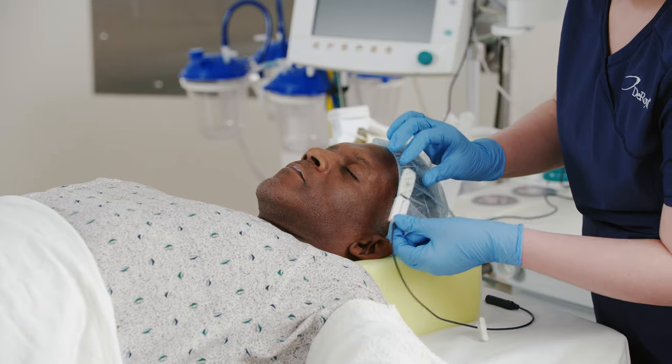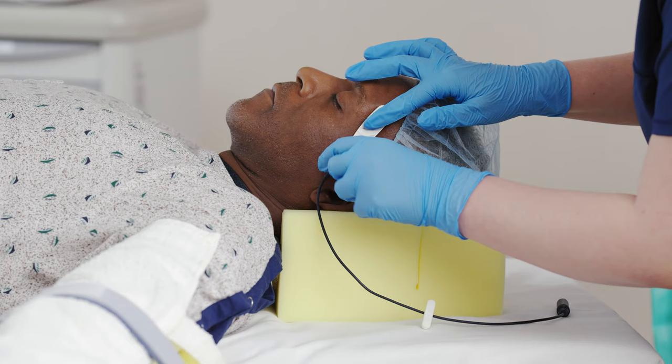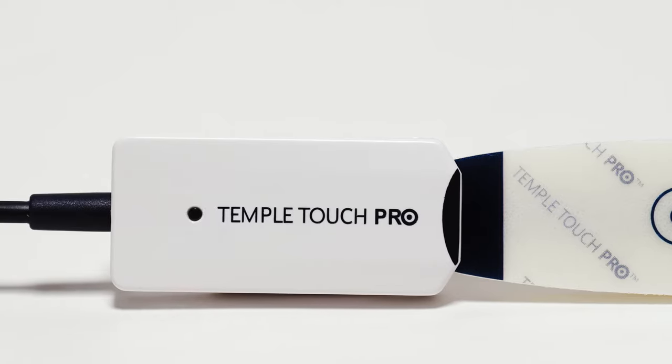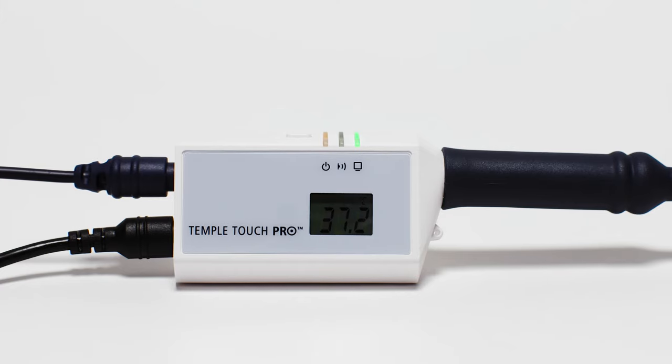The Temple Touch Pro sensor attaches to the skin above the temporal artery and measures temperature. The system then uses a patented algorithm to calculate and display core temperature.